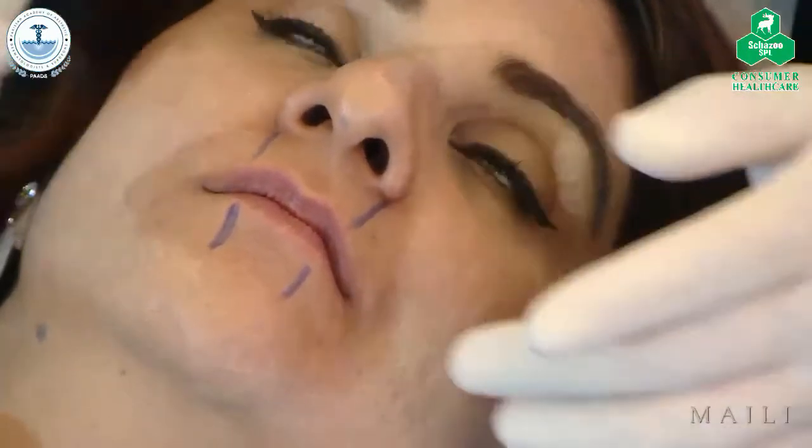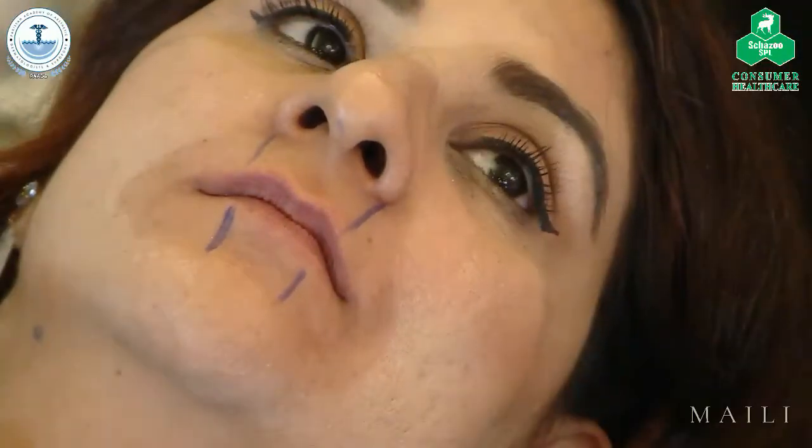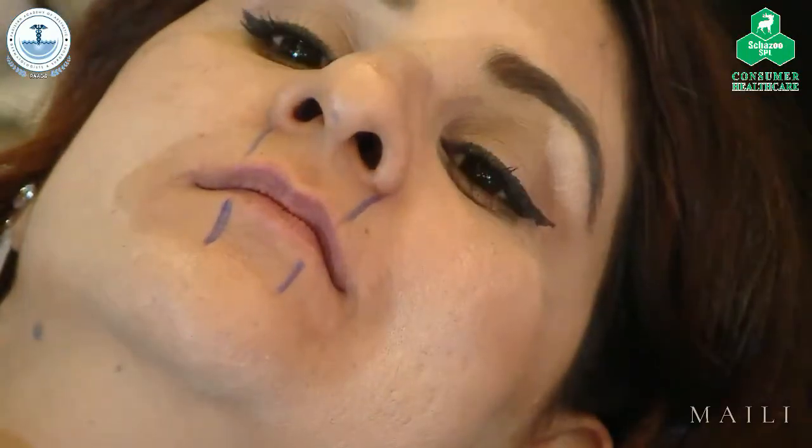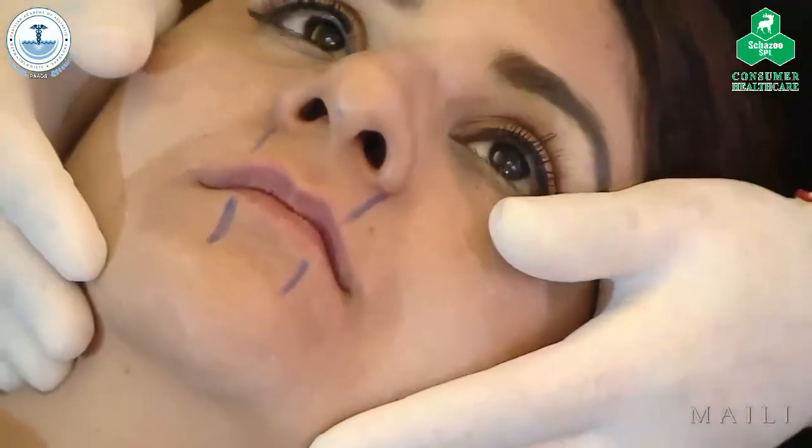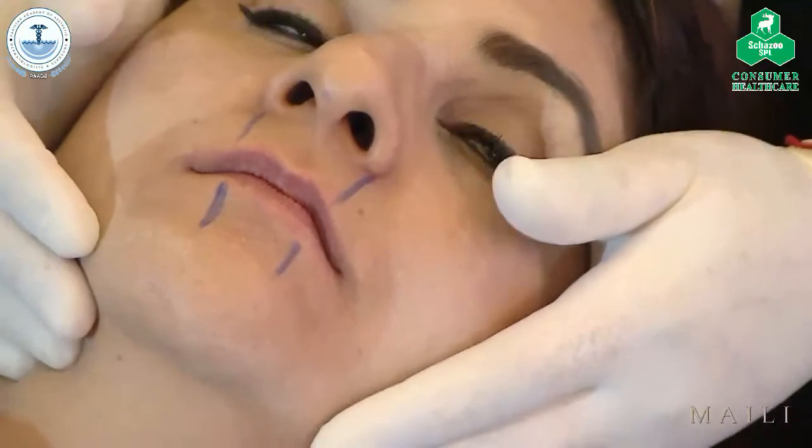And lately I've been doing a lot of removal of fillers from the lips or fibrotic tissue. So I'm going to start off using a needle, and in her case, because I want more volume, I'm going to use Define, not Precise.